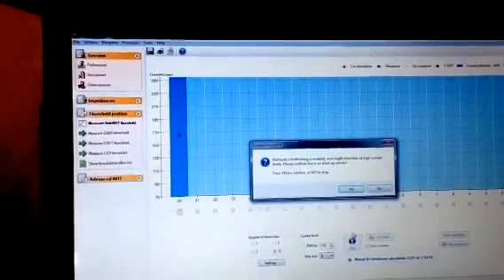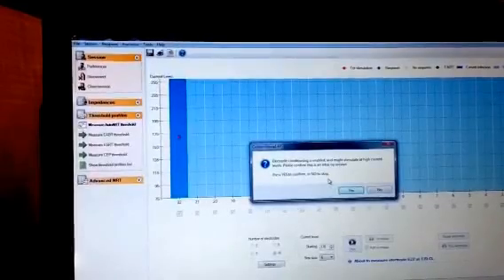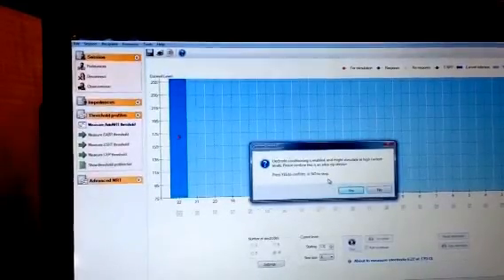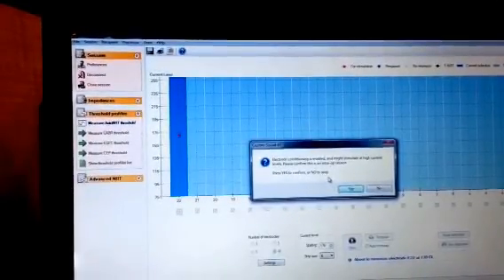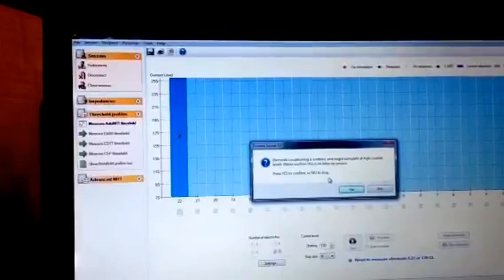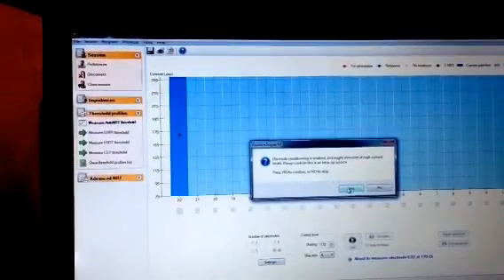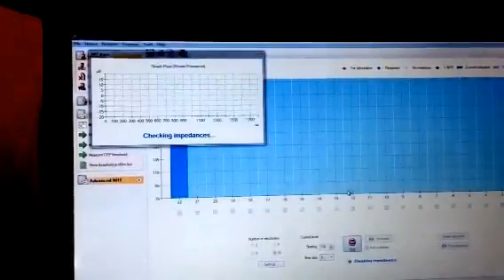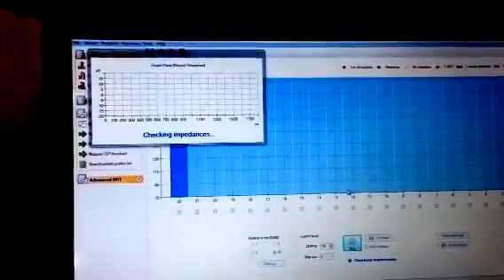This is the first message that is coming. It's talking about electro conditioning. It will tell me that you are going to stimulate at a very high current level. You need to say yes.